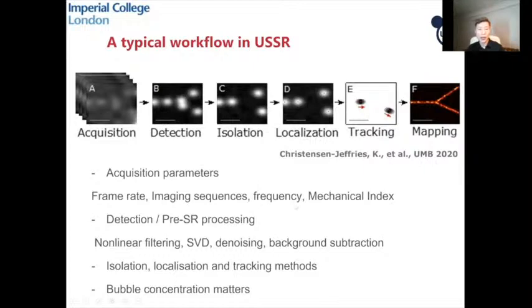But at higher frequency, many bubbles are not very active on the ultrasound, and your signal could be weaker. Another parameter is the mechanical index, and we know that in bubble imaging, you always use a lower mechanical index. If it's too high, you can pop the bubbles.